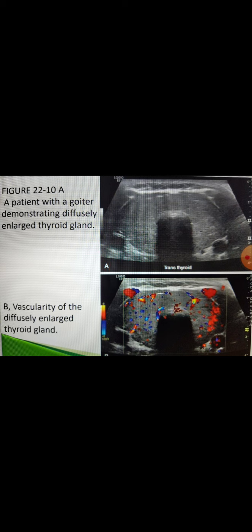I'm repeating the main points again. Whenever you find nodular thyroid disease, it can vary. There can be diffuse symmetric gland enlargement, or there can be localized discrete nodules, and the enlargement can involve both lobes and also the isthmus, and you will find several nodules, which we will describe as multinodular goiter.